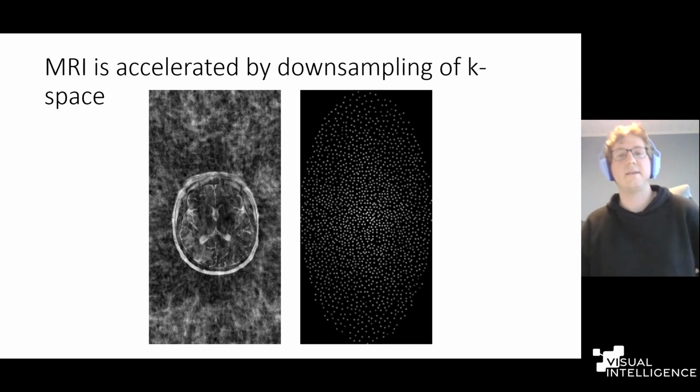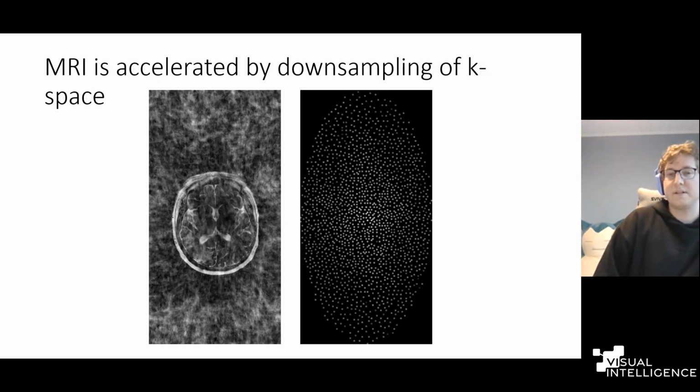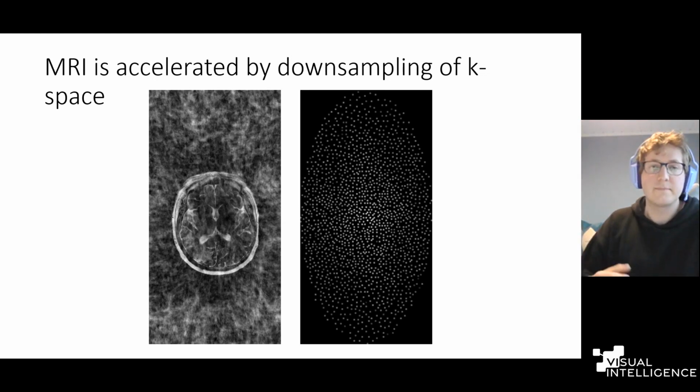And you can also see that the pattern of downsampling highly affects the image. The last one was more blurry, more stretched almost, and looked like it was duplicated on the sides, whereas this one is more noisy. So it affects how the image looks.